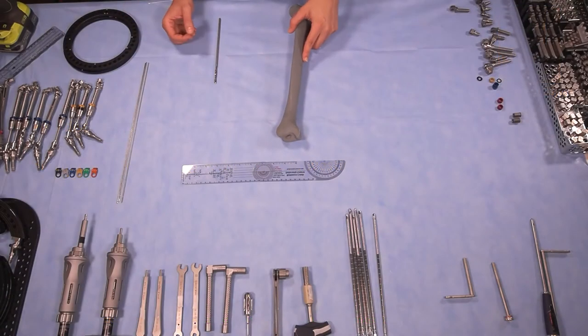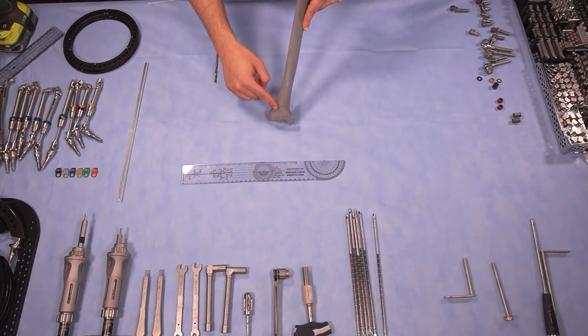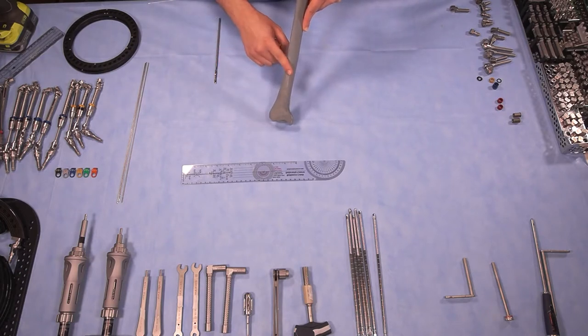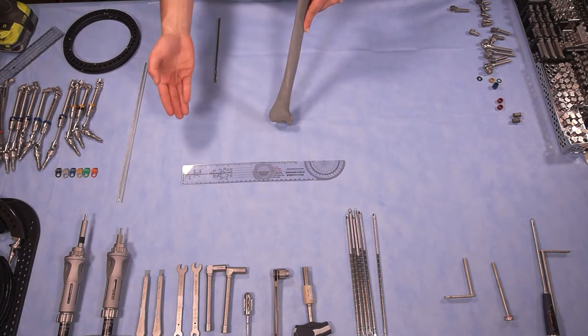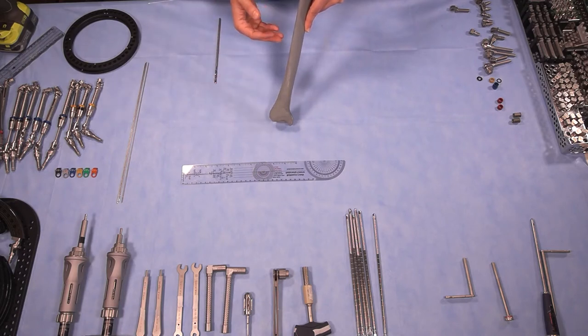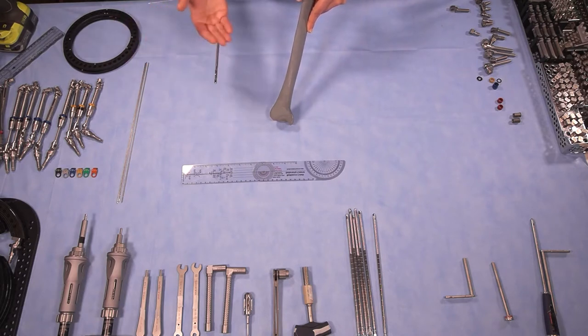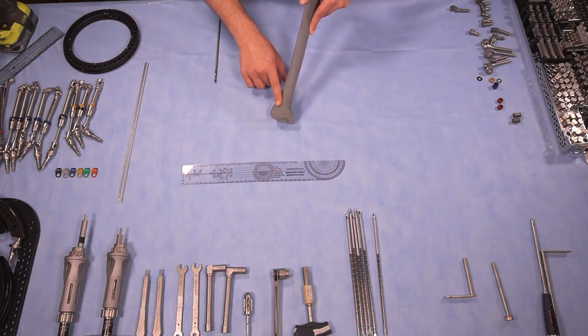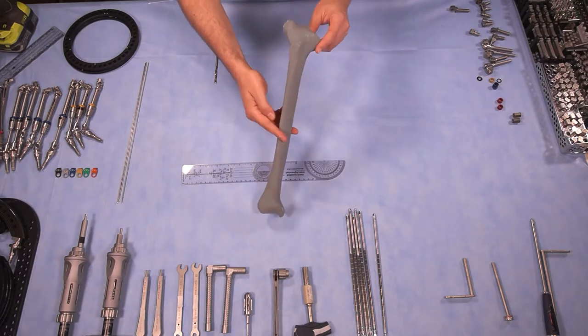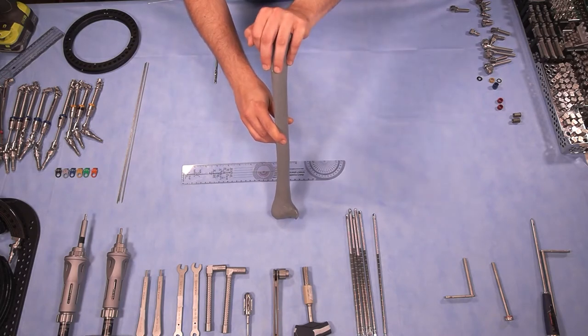Today we're going to learn how to apply a circular hexapod external fixator to correct a distal varus tibia deformity. This kind of deformity can occur from growth arrest due to infection, due to trauma, or as a malunion from a fracture. There are many more etiologies, but this particular case depicts a growth arrest. Note that this tibia also has a proximal deformity that we're going to ignore for this video.